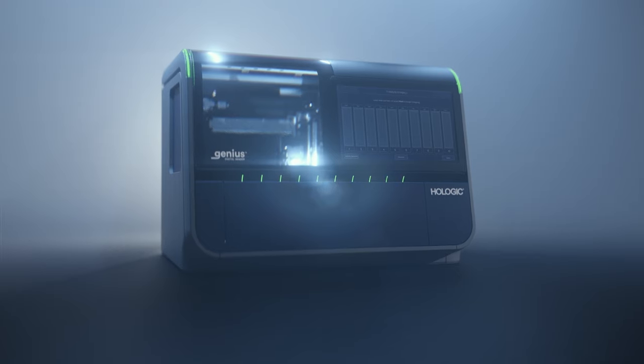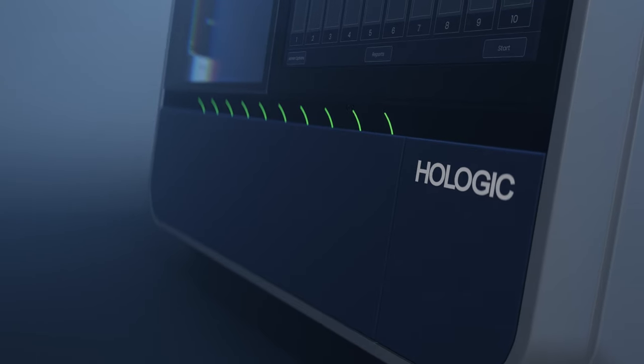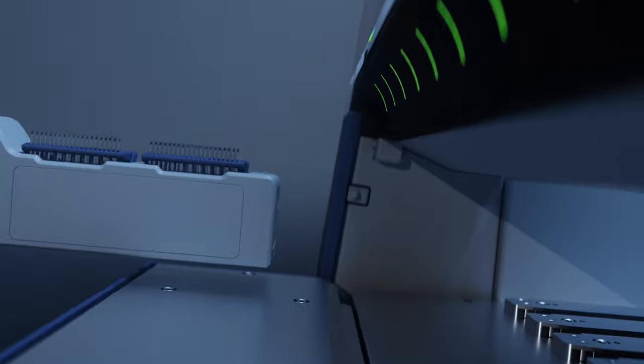To image thin prep slides, simply open the door and insert up to 10 ergonomic slide carriers, each holding two standard slide racks for up to 400 slides at a time.